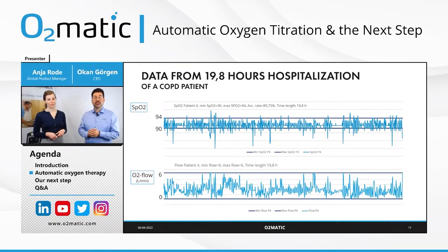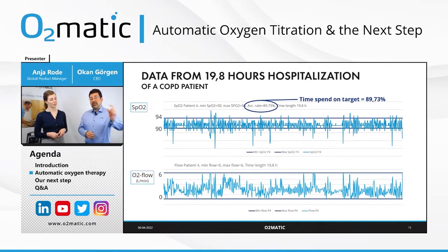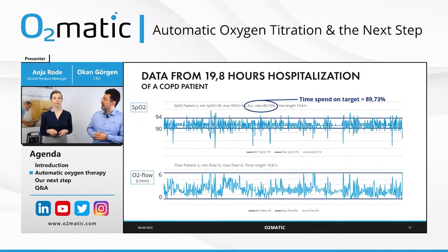Yeah, so the lower chart here is the oxygen, where you also can see it is set in an interval. And you can see how many times the device is actually adjusting the oxygen to keep the patient within the interval. And even though we are doing this, and you can see every second, it has managed to keep the patient within the interval for 90% of the time. And you can see the fluctuations where it's below or over. That is very, very small. The oxygen saturation, right? Yeah. Exactly. It's very small amounts of time, so it's not that important.